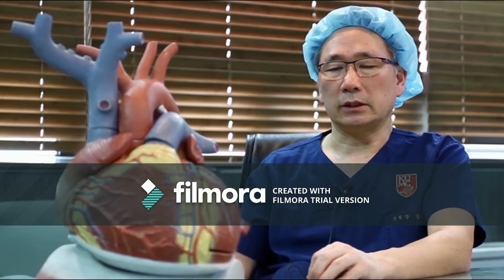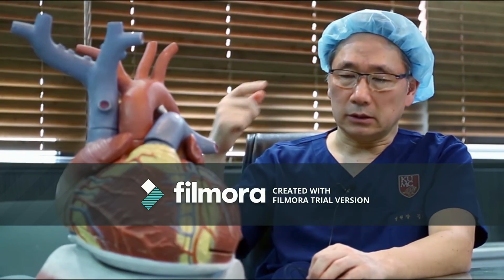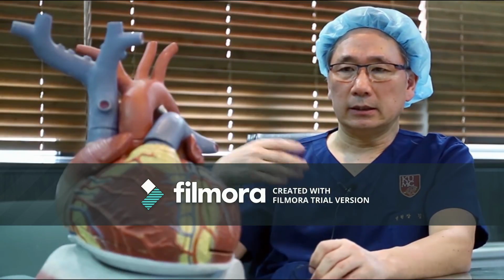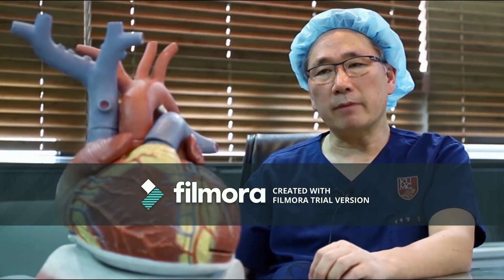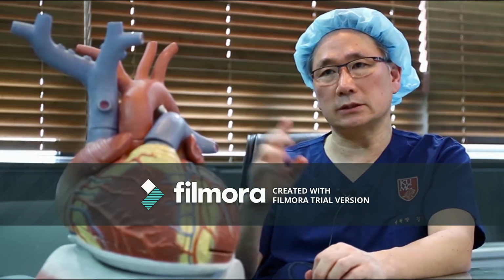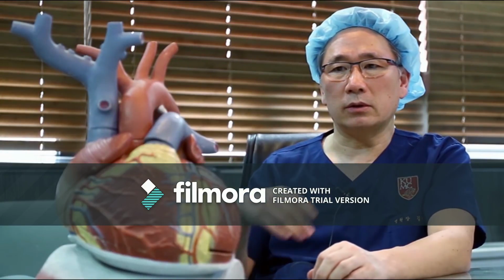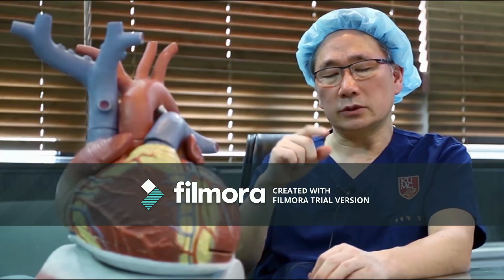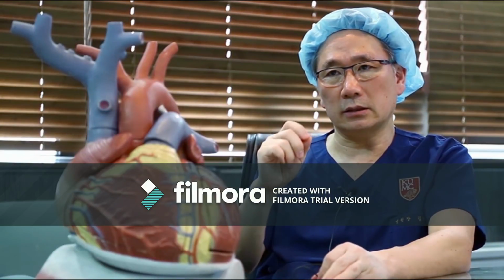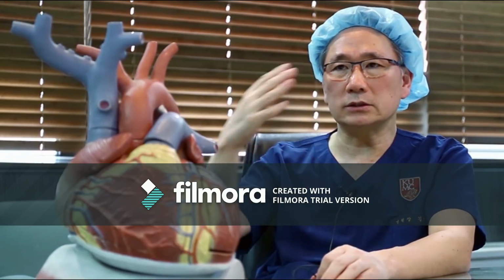So if we have an atrial tachycardia that can be mapped, we do the activation map and entrainment map, and we target at least the mappable ones, with a cycle length longer than 230 milliseconds. We try to map. In our lab, the mean number of atrial tachycardias is at least 2.7, so more than 3.